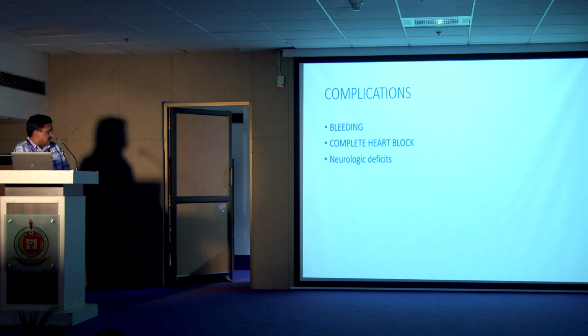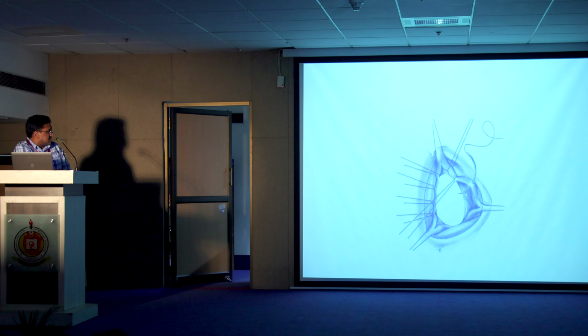Neurological deficits in aortic valve replacement are because of retained calcium particles or inadequate deairing. This is the diagram which shows this, suture taking injuring the bundle.